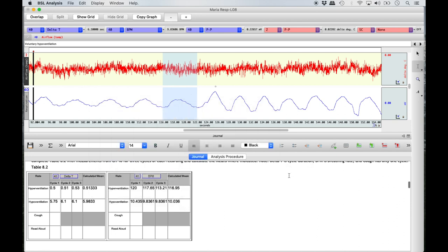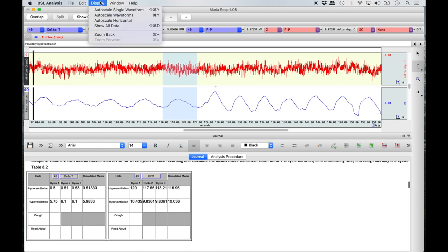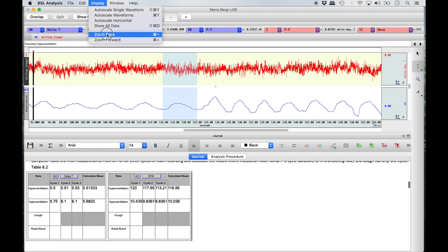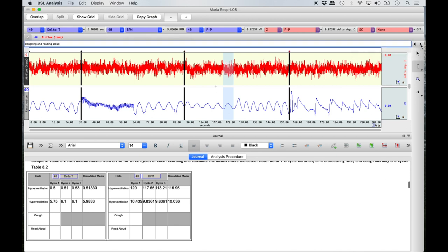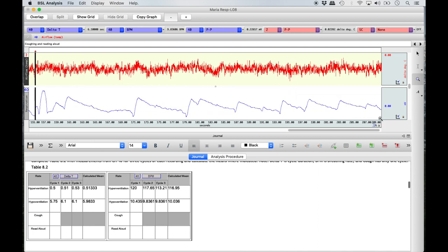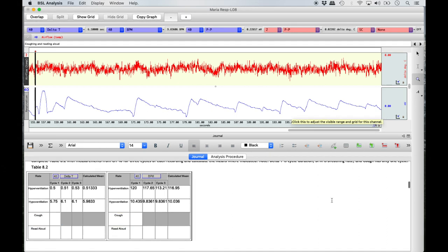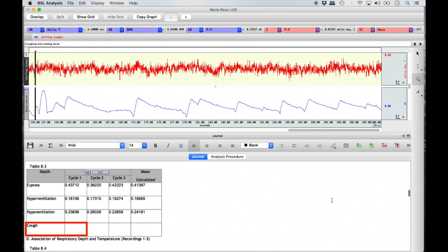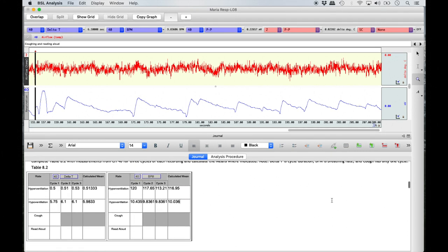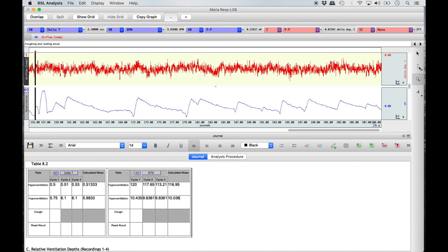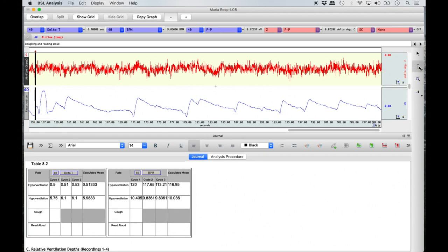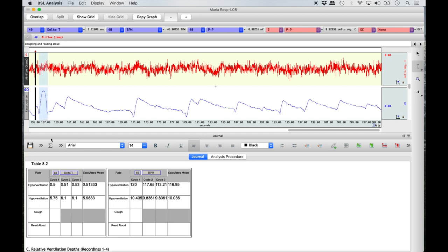Once all hypoventilation rows are complete in Tables 8.2 and 8.3, zoom back to the full screen view and then magnify the cough and reading aloud segment of the recording. Only one measurement is required for the cough condition in both halves of Table 8.2 and in Table 8.3, even though some columns may not be shaded in. The cough should be located at the beginning of the recording where a sudden high peak and quick drop in the waveform is visible. Using the I-beam tool, highlight the cough from valley to valley and insert measurements into Tables 8.2 and 8.3 as previously done.